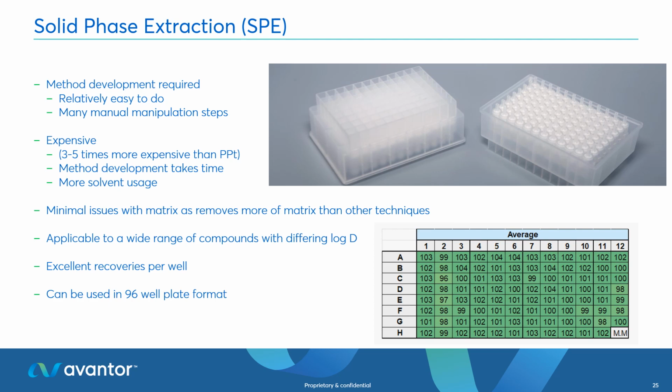There are quite a few manual steps to perform for the analysis of oligonucleotides. So in this presentation, we'll give you an introduction to some of the developments of the chemistry, but there is still more to be done in the method development. If you like, there's a part 2 coming up. It is more expensive than protein crash, but in this case, we need that selectivity, and so we'll be applying the brute force of solid phase extraction in order to get that.